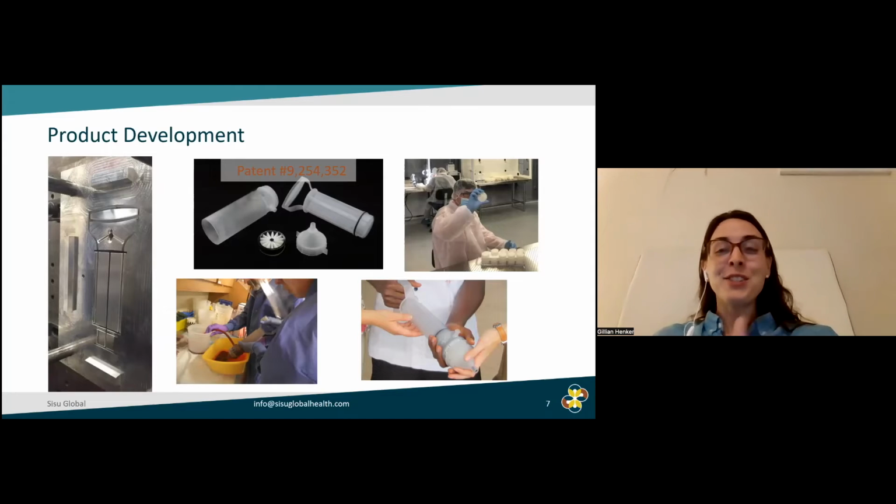It was interesting to hear from the digital side. As a physical device, 3D printing was really an amazing tool for us as we went through and iterated on different models of the device before going into the design freeze that was described earlier on, having to put things into metal and to really make what is closest to your final device.